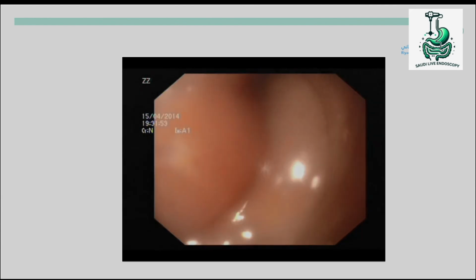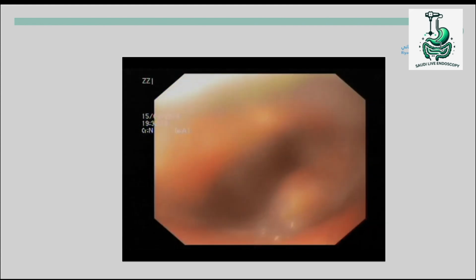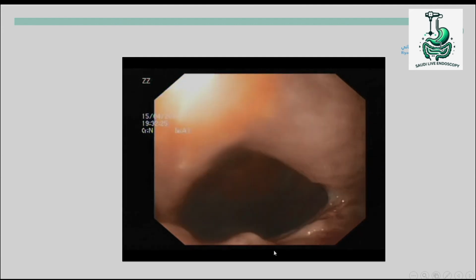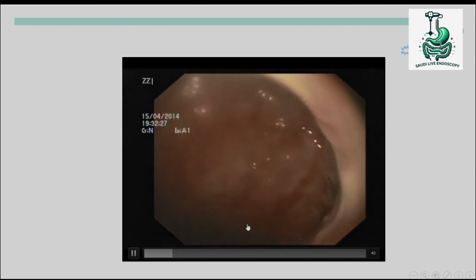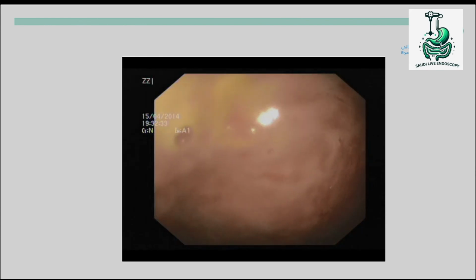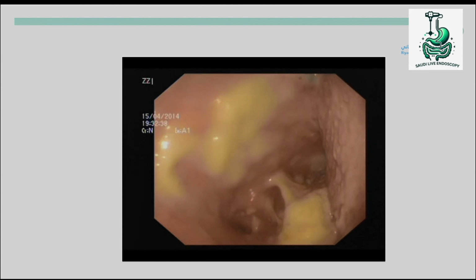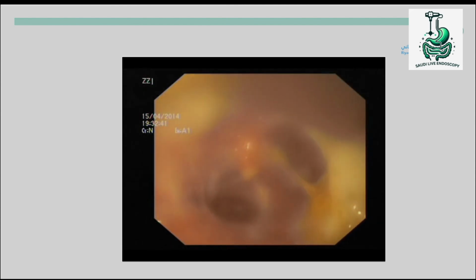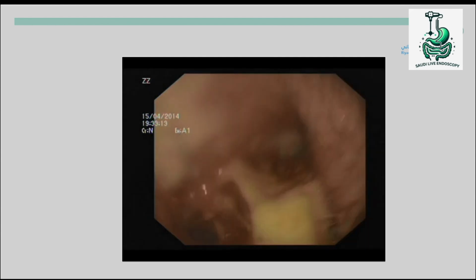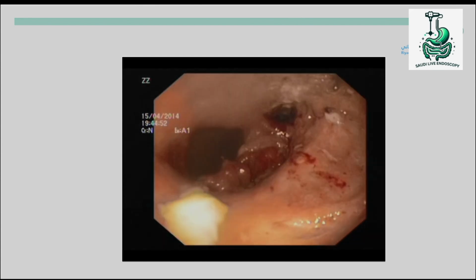So we come to appreciate that about 50 to 60% of the anastomosis is completely disrupted. You see here, these are the intact sutures, and all this is the jejunum. When we find access going outside into the abdominal cavity, this is something I'm actually very happy with. We don't just pull the endoscope out and call the surgeon. This is a very good opportunity for me to do some lavage, some cleaning. We use baskets, we use continuous lavage with saline, sometimes antibiotics, to clear the leak cavity or the peritoneal cavity, and then we proceed with our procedure.